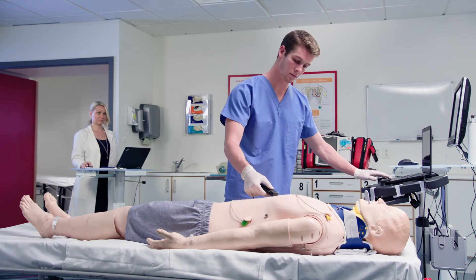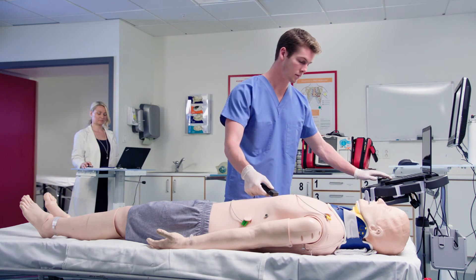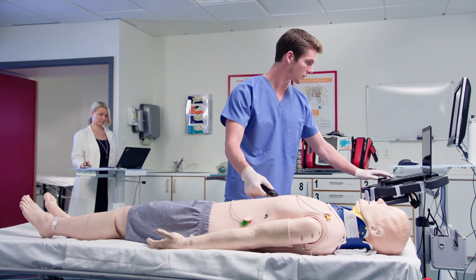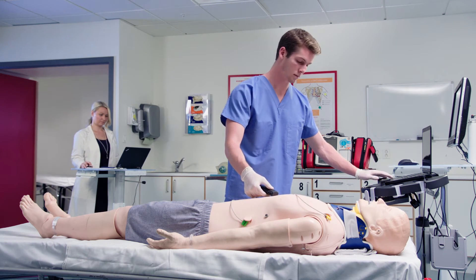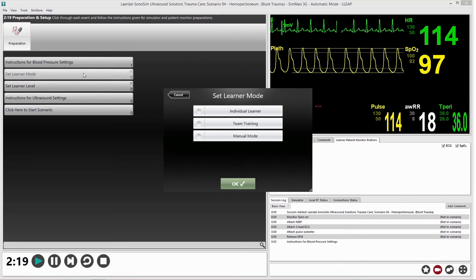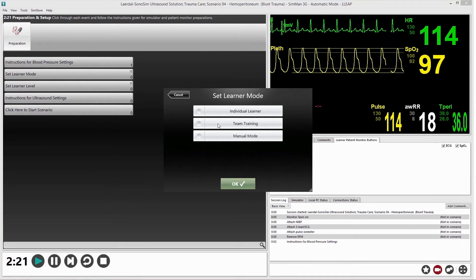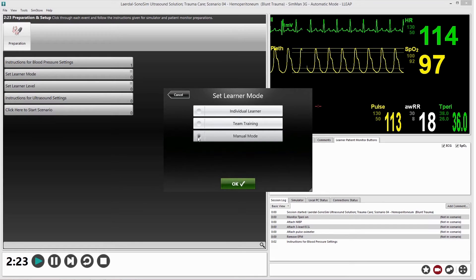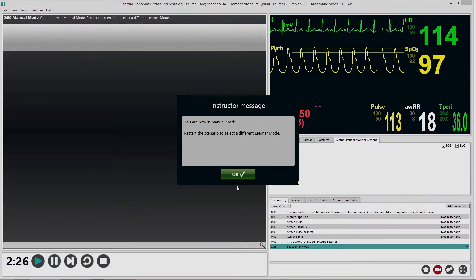For simulation centers and educators who do not want a pre-programmed scenario, manual mode provides the same ultrasound images and resources that can be used to create a scenario they design or operate on the fly.